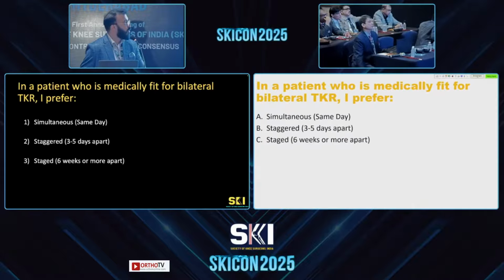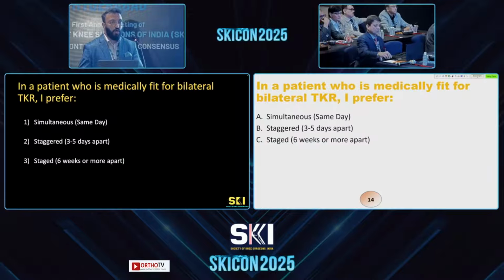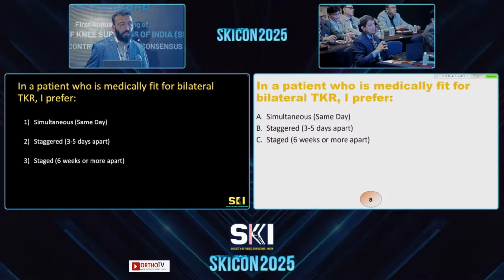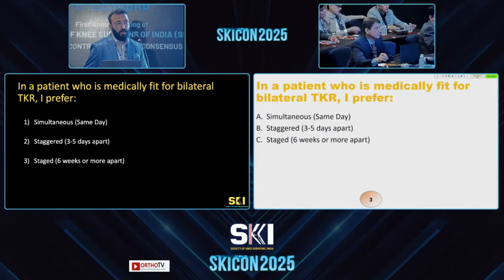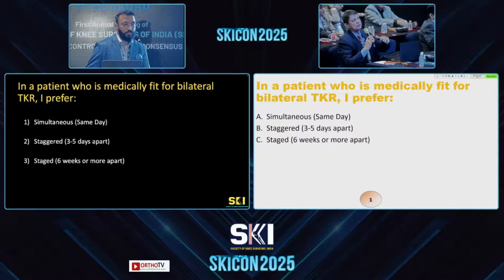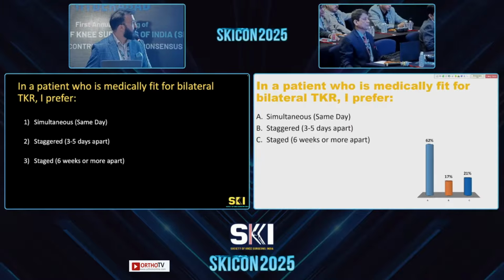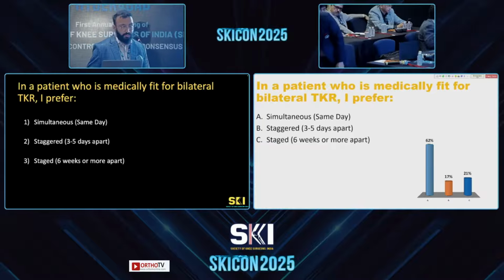In a patient who is medically fit for bilateral TKR, I prefer option number 1, simultaneous same day. Option number 2, staggered 3 to 5 days apart, same admission. Option number 3, staged 6 weeks or more apart. You discharge the patient and call them back. That is stage the C. So 62% are preferring simultaneous, that is same day, bilateral TKRs.